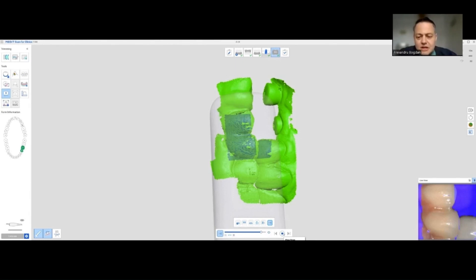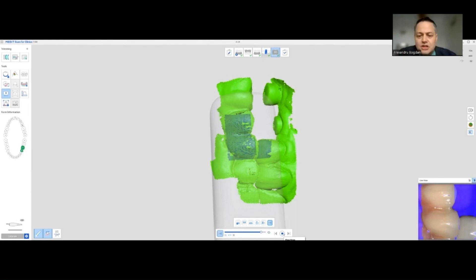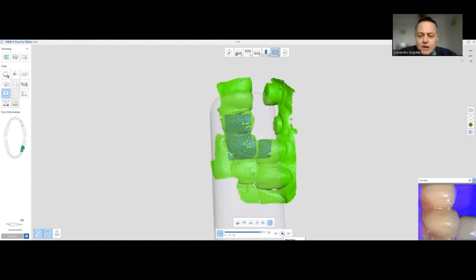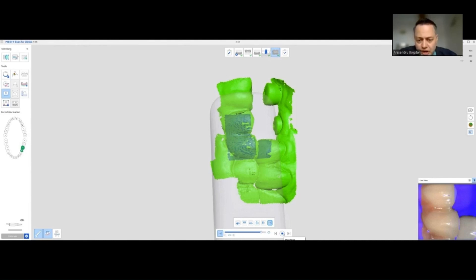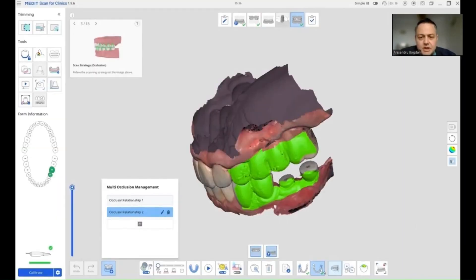When I take the scanner outside the mouth, I tell the patient not to open up. I retract tissues on the other side and put the scanner in. I do this because patients are not going to always bite in the same spot. If I want to have a correct occlusion scan, I will ask the patient not to open and validate that the occlusion is correct. Tongue is not in our way because the patient has pulled it on the contralateral side.